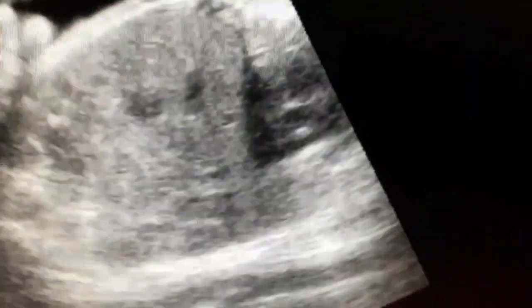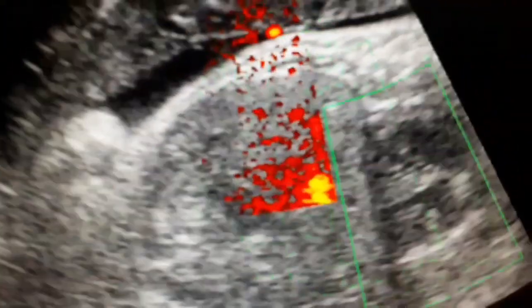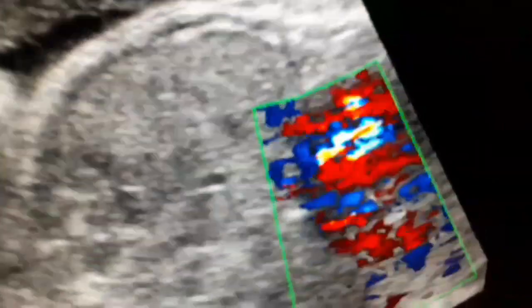Here you can appreciate the full four-chamber view of the heart. The right ventricle appears thickened due to the moderator band fiber — it is thicker than the left ventricle. The left ventricle is not as thick as the right. You can appreciate the interventricular septum as well. With color Doppler, blood flowing toward you appears red and blood flowing away appears blue.